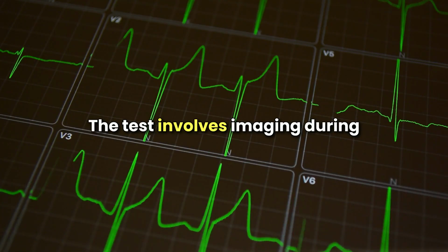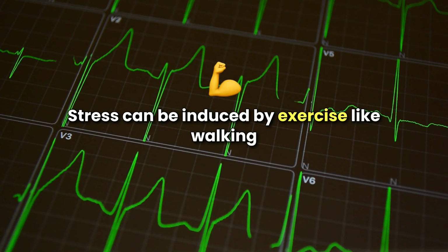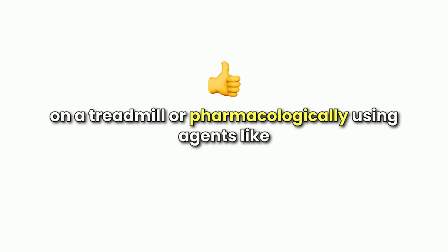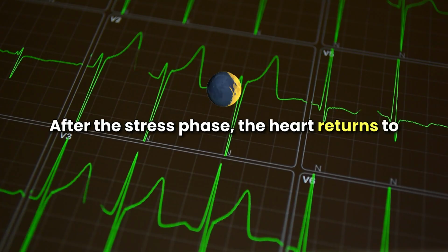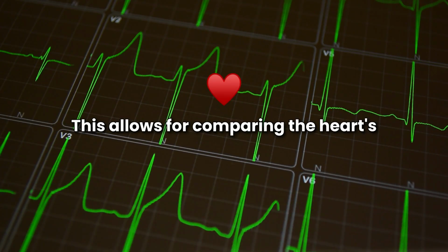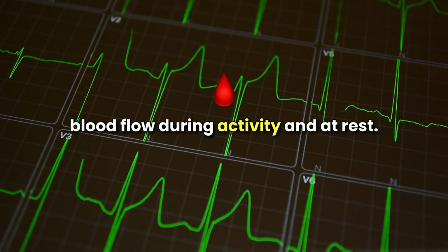The test involves imaging during two different states, stress and rest. Stress can be induced by exercise, like walking on a treadmill, or pharmacologically using agents like adenosine or dobutamine for those unable to exercise. After the stress phase, the heart returns to its resting state, and imaging is performed again. This allows for comparison between the heart's blood flow during activity and at rest.